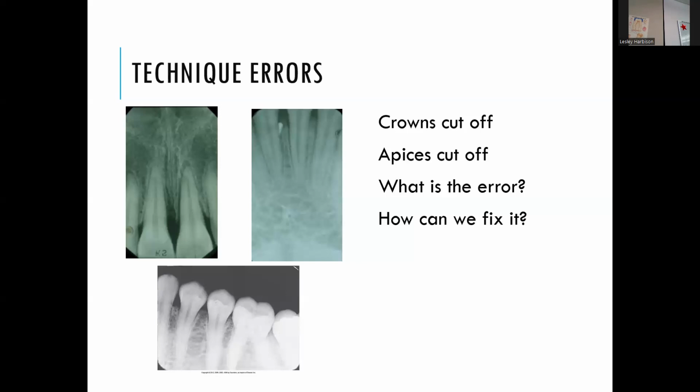They can open and it might fall, and you ran out to push the button, but they took it out, or they opened their mouth or something, and then you just have to redo it, and you have to nicely encourage them to hold still and keep biting, because the more that happens, the longer it takes. So there are some ways to work through it with the patient.